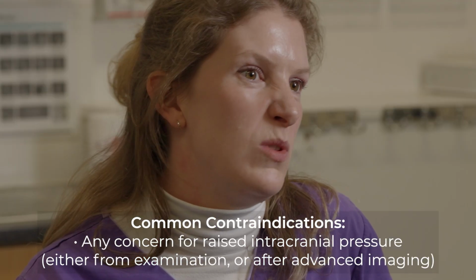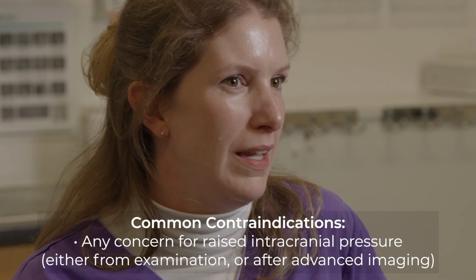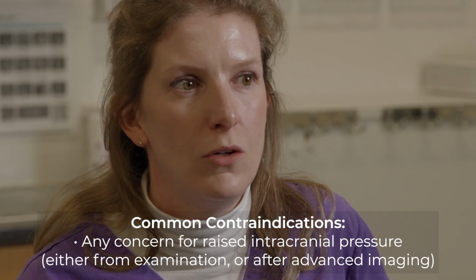So generally I would try and avoid taking spinal fluid on anything that I have a really high suspicion might have something structurally wrong with the brain, certainly without doing advanced imaging of the brain first, whether that be an MRI or a CT scan.